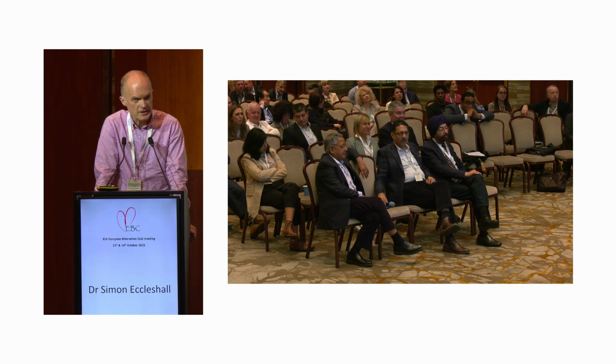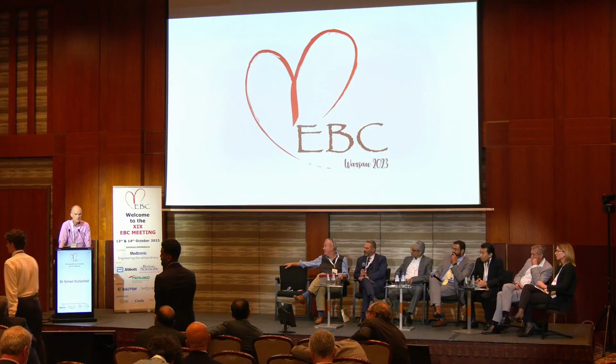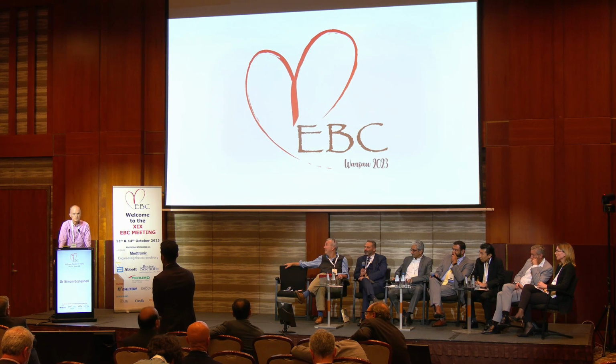So if you have a dissection, your restenosis rate is lower than if you don't have a dissection on angiography after balloon angioplasty or after DCB. Because the dissection, as long as it's a safe dissection, is telling you that you've done an adequate lesion preparation. So I agree with you.